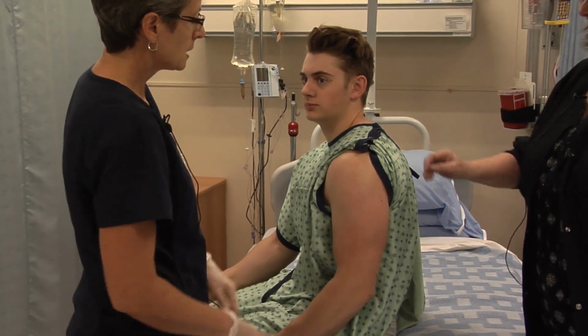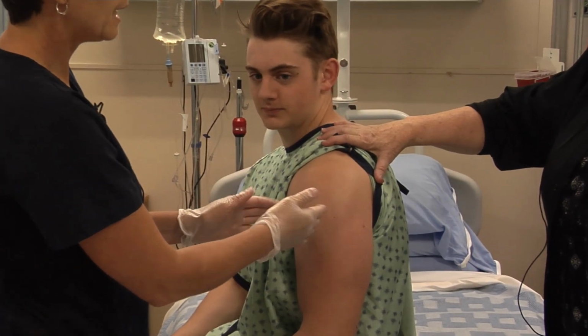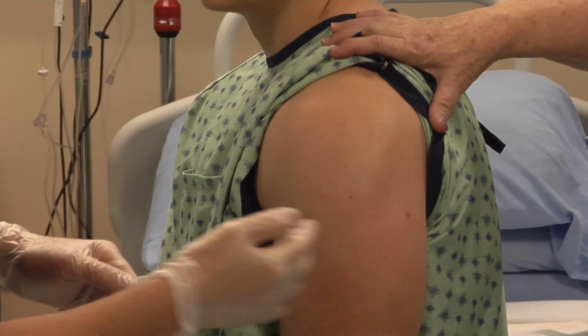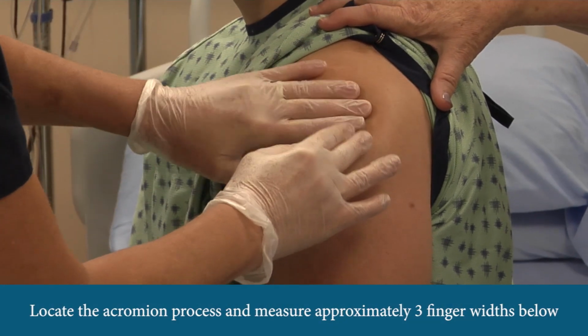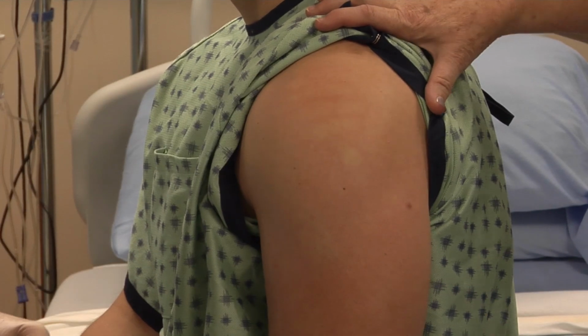No. Okay. So Ross has a really good deltoid muscle in terms of mass, and so this will be a good choice for an injection for him. I need to landmark to make sure I'm getting it into the right place. So I can find an acromion process. I can go 3 finger widths down, and then I always do this poke test to make sure that I have enough meat.